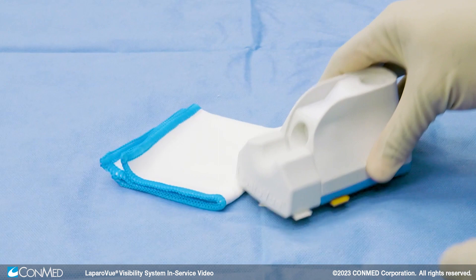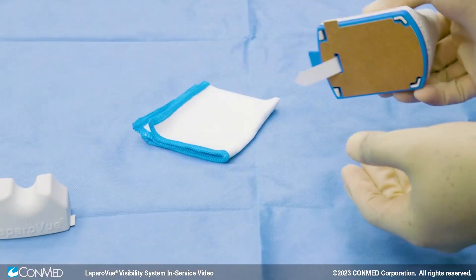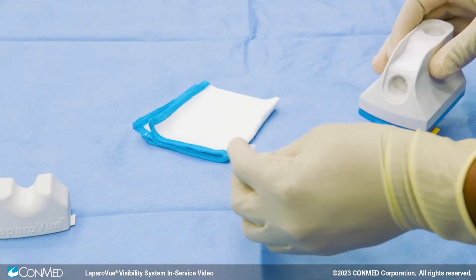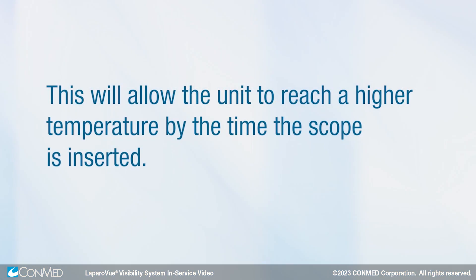To set up the Laparovue unit, separate the scope cradle from the main unit, then pull the pull tab on the bottom of the unit. For use in a laparoscopic case, pull the pull tab while the room is being set up.